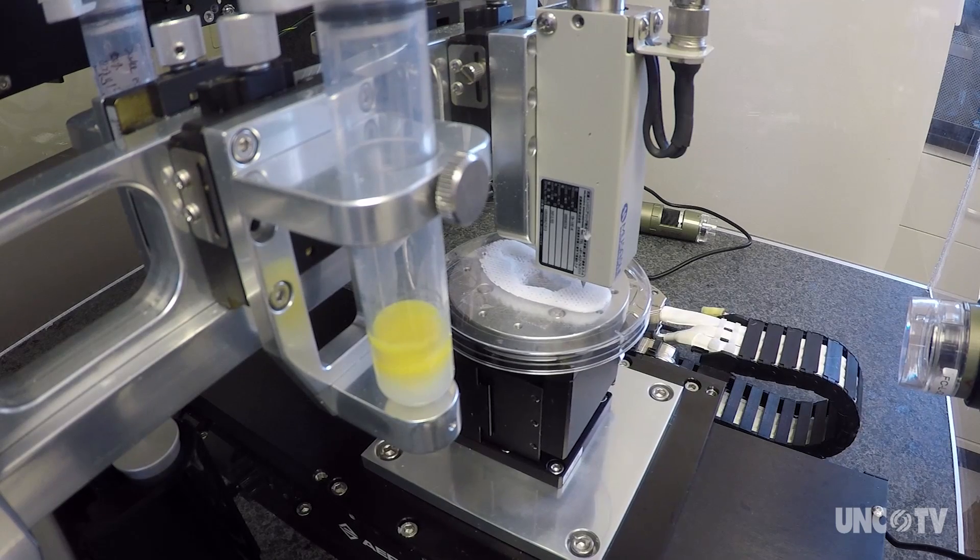And we then print these structures one layer at a time, and as we print the cells we're also printing the structure that holds it, the glue if you will, so we create the structure together.